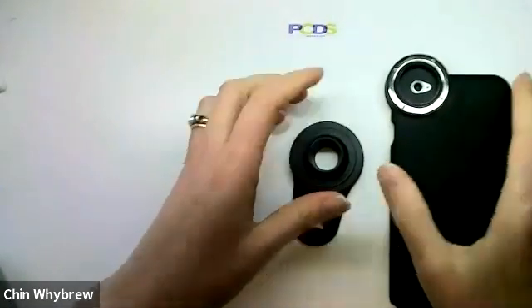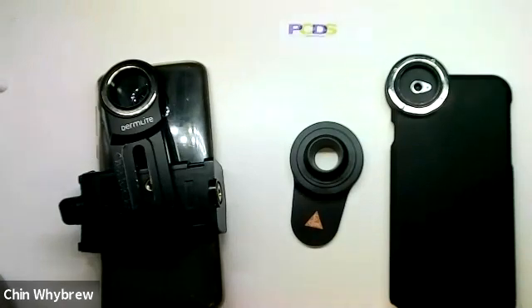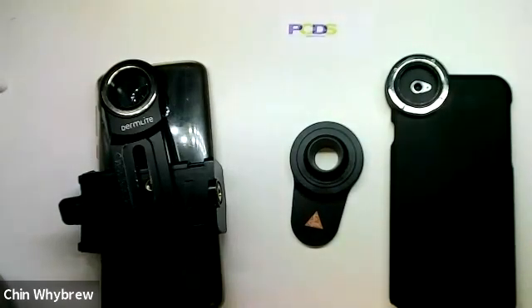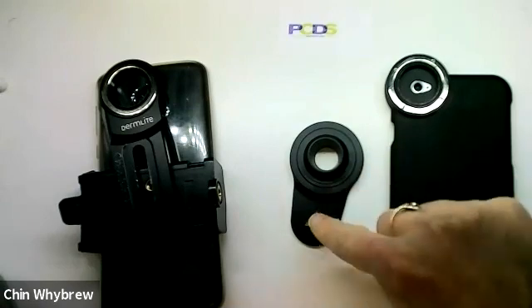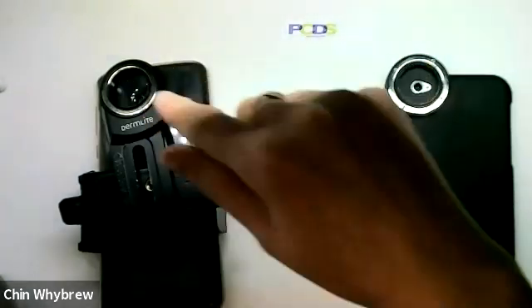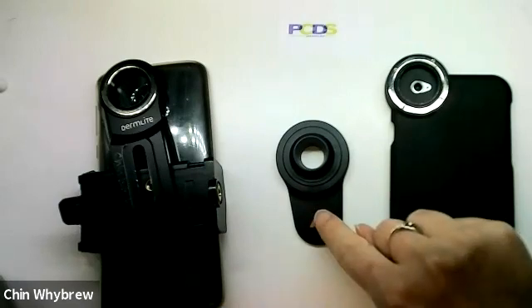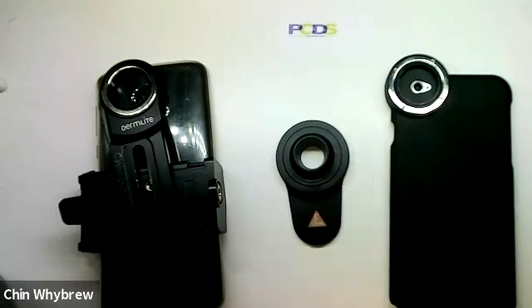Those are the three types of adapter you can get to attach your dermatoscope magnetically to a mobile phone, and that's which ones you can use with which of the standard dermatoscopes. The Heine one will only work with Heine dermatoscopes. The Dermalite ones will work with all of the dermatoscopes including the Heine ones, with the exception that the Heine Delta 30 does work better with the proper Heine adapter. But all the others work absolutely fine with the Dermalite one.